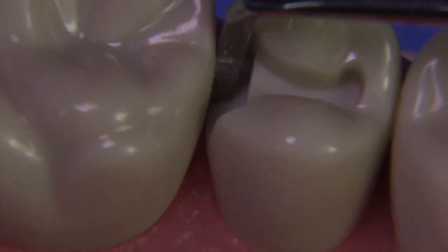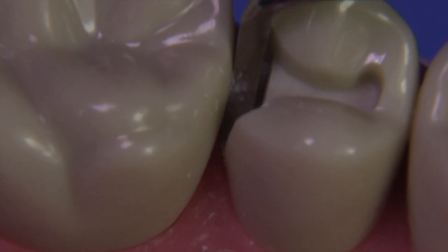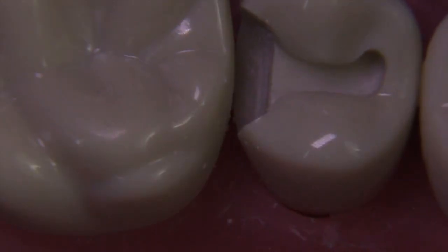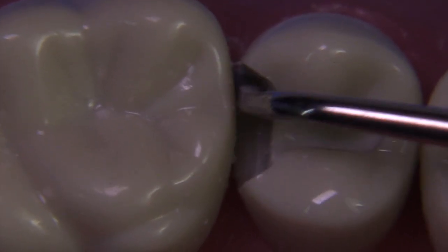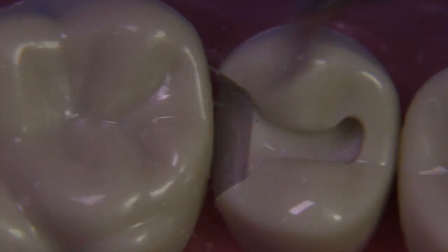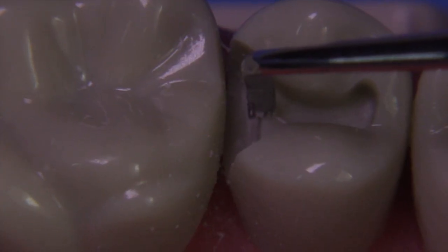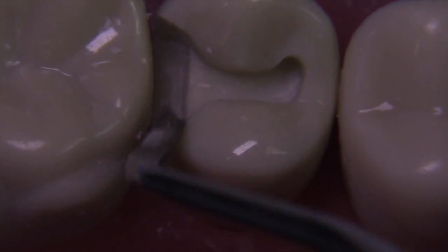After finishing that, let's go to the gingival margin trimmer to create the gingival bevel — about a 15 to 20 degree downward slope to make sure the enamel rods are not undermined. It should be the entire thickness of the enamel, so it's a pretty wide bevel. Start in the middle and just rotate the instrument, then slide it across. Never start on the buccal side and slide all the way to the lingual. For the axial pulpal bevel, start the instrument in the middle, rotate it to get the bevel started, then flip the instrument and perform the same maneuver going the other direction toward the facial.